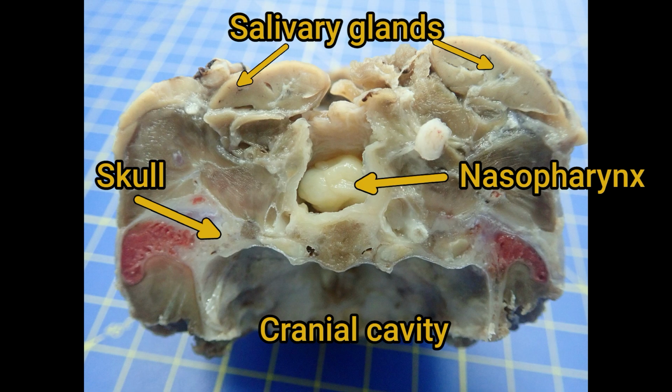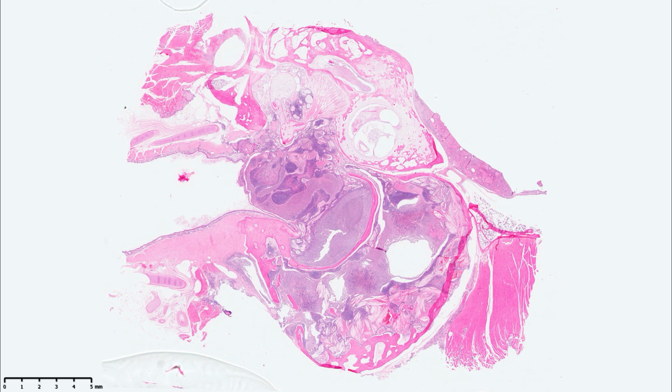Blocking the cavity, there is a mass of tissue. But what could it be? Well, there's only one way to find out. Look at the cells that are making up the tissue and characterize it based on their morphology. So, more histopathology. First of all, let's look at the ear.